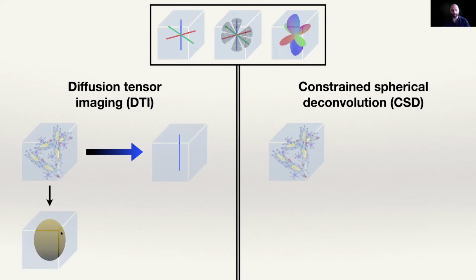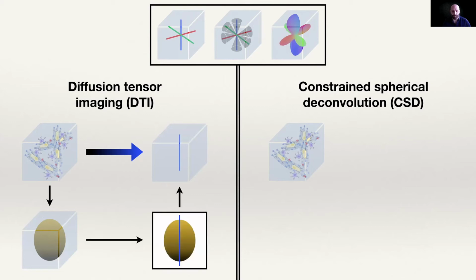So you're going to try to fit pretty much 1 exponential in this, with 1 diffusion tensor representing the average of this. And from this, you're going to isolate the main orientation of that diffusion tensor, assuming, for example, it is axisymmetric. But even though you can always take the axis with the largest eigenvalue, it's going to take you this direction. And this is the peak you're going to get. That's it, done. The other one, CSD, is going to do something slightly different.